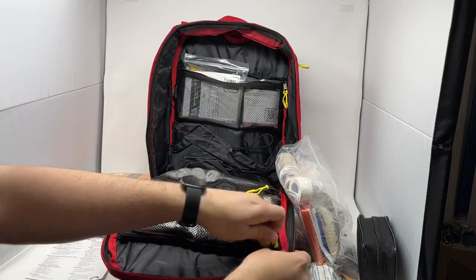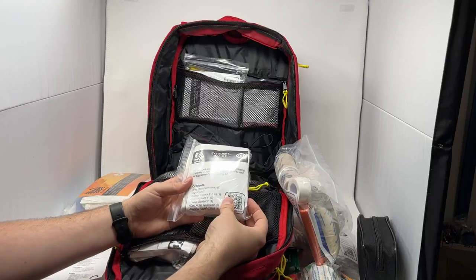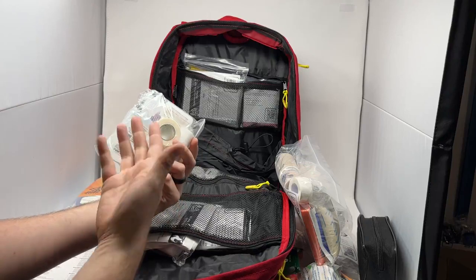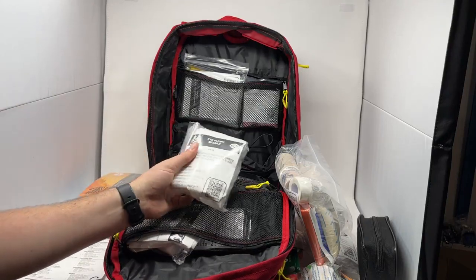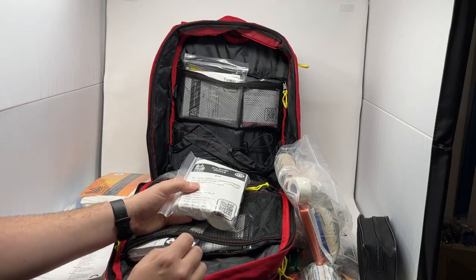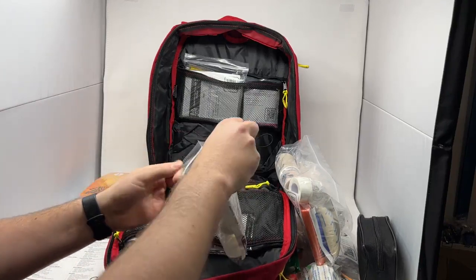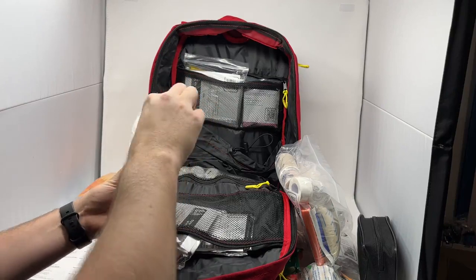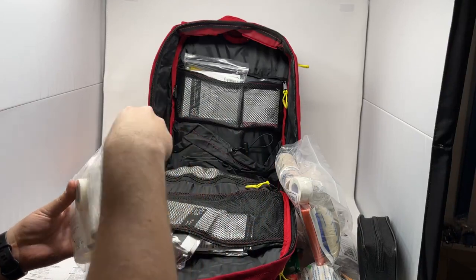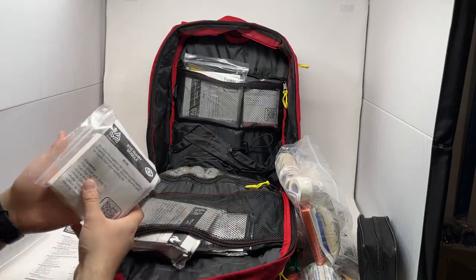Up top here we have our eye injury module for dealing with eye injuries. This comes with two eye shields, two eye pads, a saline irrigator bottle for irrigating eyes — which can also be used for wound irrigation — two four-inch roller gauzes, one two-inch roller gauze, two cotton tip applicators, and a half-inch roll of medical tape. Just like all our other modules, on the back of the cards they come with a guide. Every single module will always have a guide, helping you walk through how to use it. They also all come with a QR code on the front that you can scan to get videos on how to use the gear.